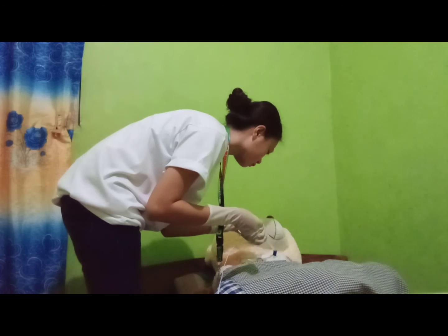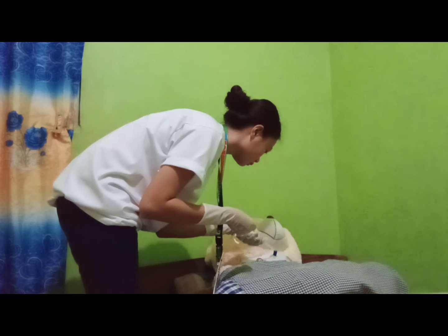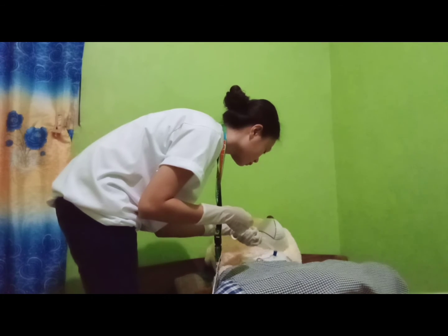Apply suction by placing thumb of non-dominant hand over open port. Rotate the catheter with your dominant hand as you withdraw the catheter. This should take 5 to 10 seconds.